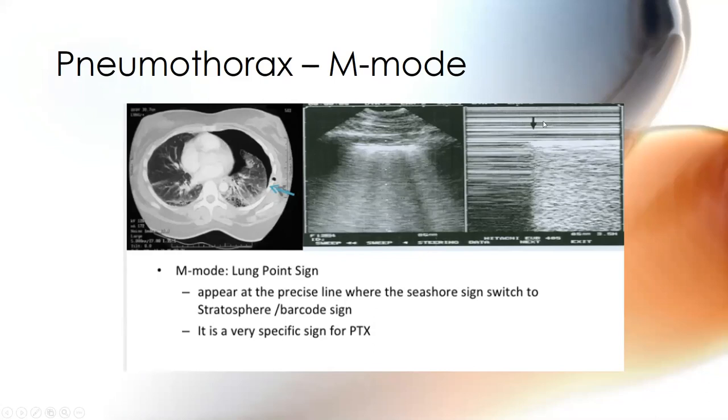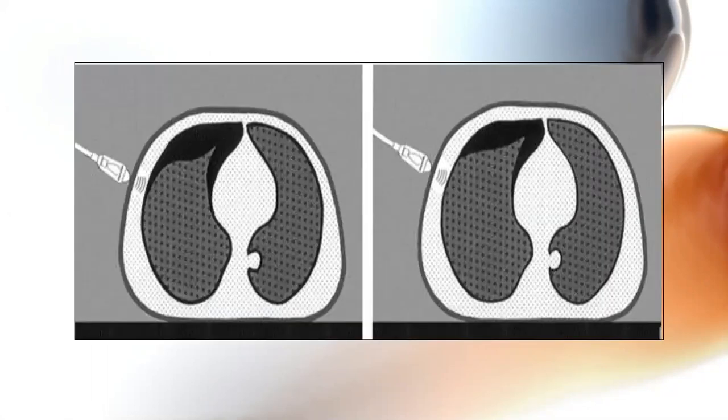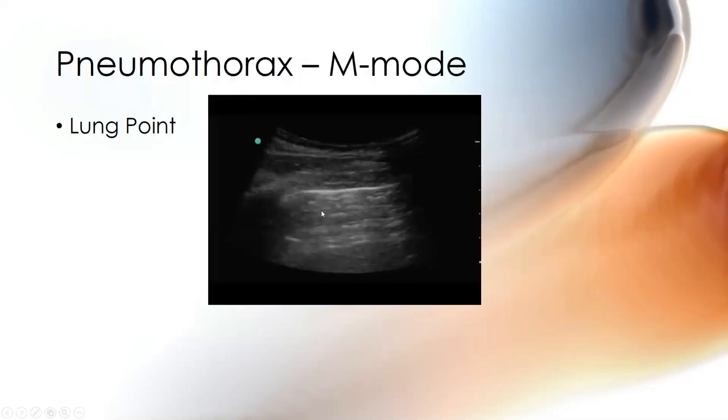So this is a much nicer example, the live image. I've got lung coming in and out. This point shows you how big that pneumo is. In another example, where you put the probe, as the lung inflates, it crosses the field. And as it deflates, then I have a whole bunch of non-sliding lung. Not all the images are this beautiful, but this is a really beautiful image.